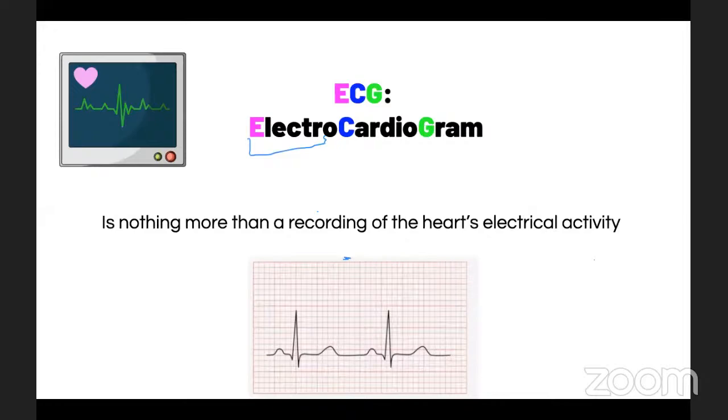What does it mean? Anyone know what electro stands for? Exactly. I read some in the chat box say electricity. Perfect. Yeah, electricity. So electricity or electrical activity.